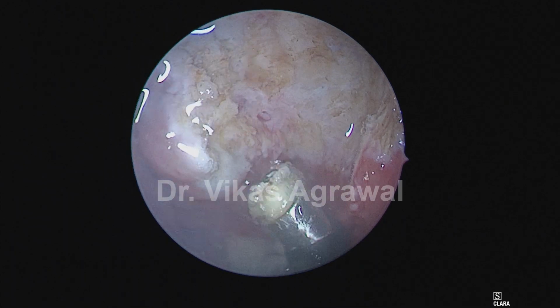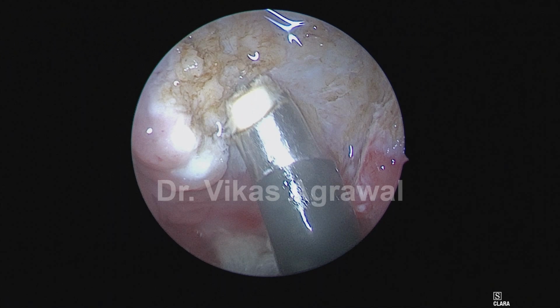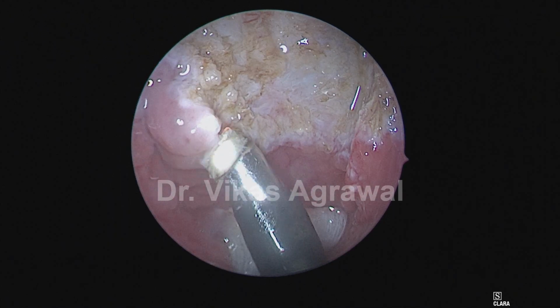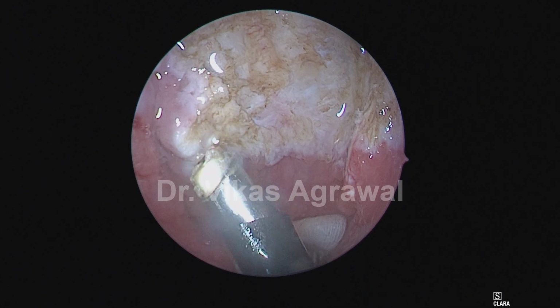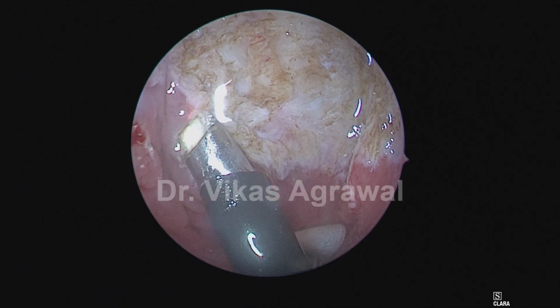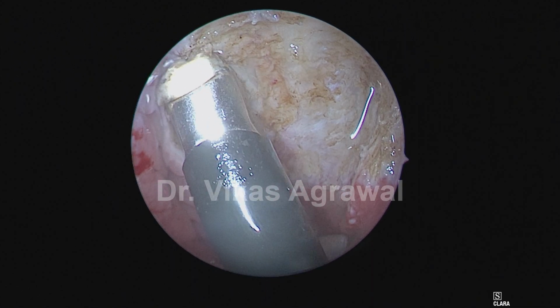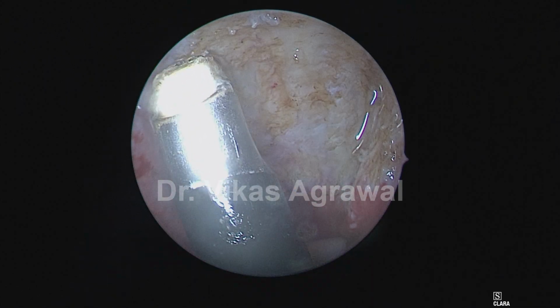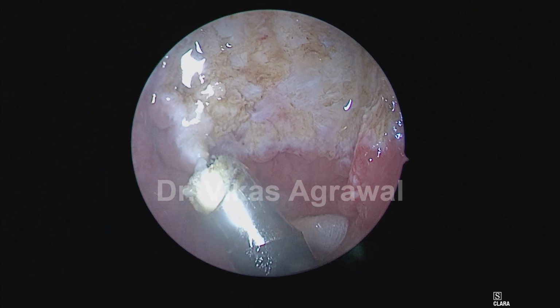Now you can see that the power of this wand is actually getting lower and lower. Still working, but it's not as nice as it was working earlier, which is normal. So this wand will be worn out by the time we finish the surgery, or sometimes we may even have to open up another wand in the same surgery.